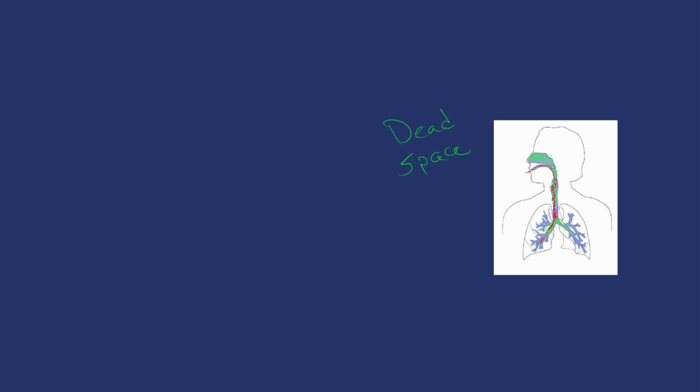So there is a lag time whenever we're doing our capnography because of this. Okay. So now knowing that, with our respirations and how CO2 is going to change here, we'll draw this out. So we breathe in. As we breathe in, and if we're measuring right here at, say, the mouth, the level of CO2 isn't going to change from the air. It's going to be just a flat line. There's no change here.